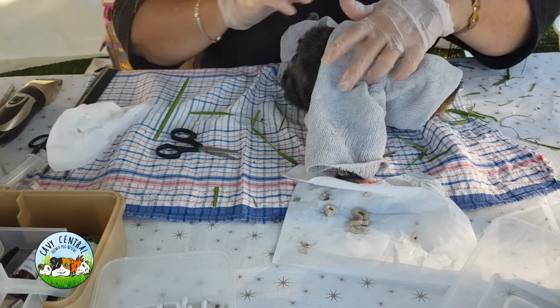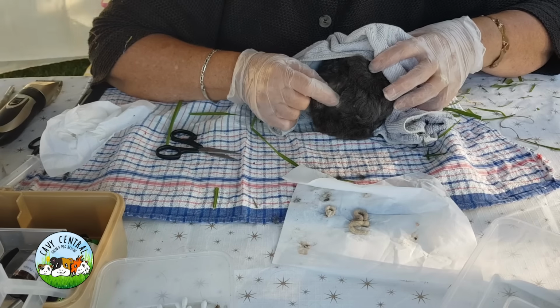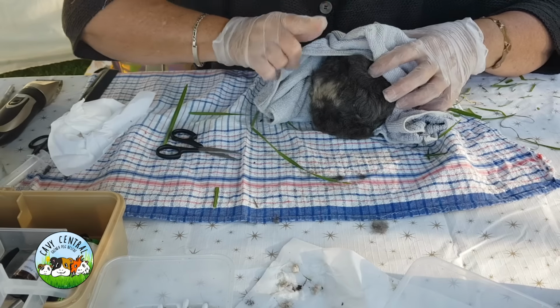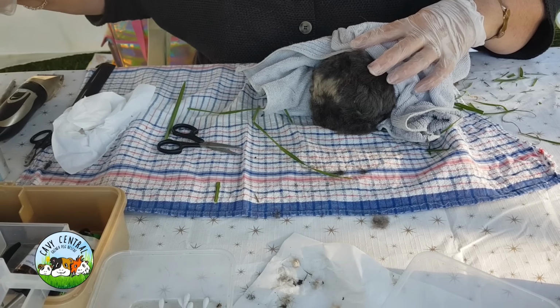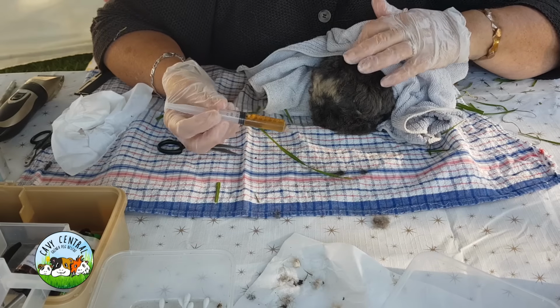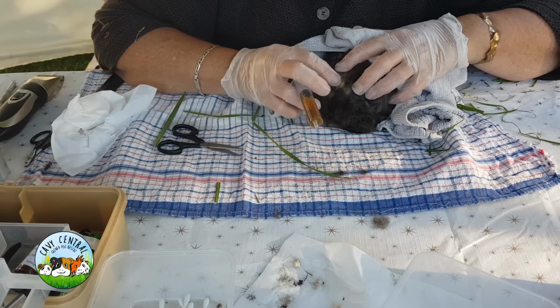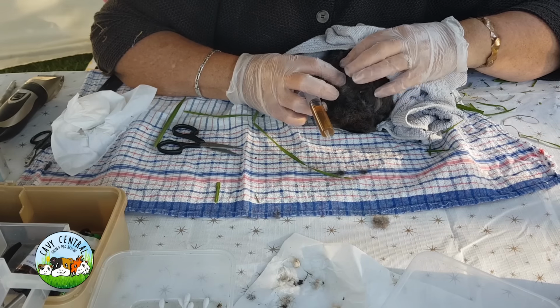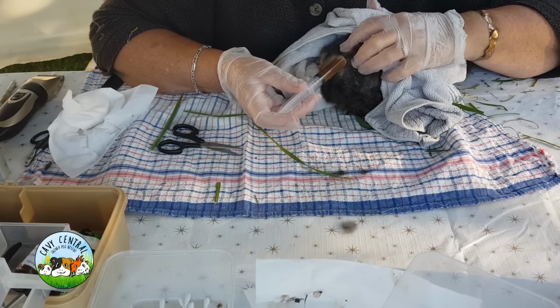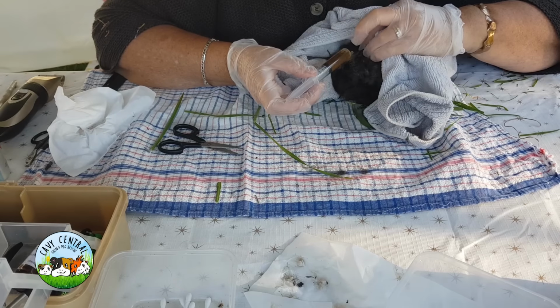And there we go. That is completely empty. Look how neat and tidy that is. Now, the contents we'll come back to after. But what we need to do now is rinse that with Debrazole. Debrazole removes necrotic tissue. Necrotic means that the tissue is basically dead or dying skin cells. And I can barely see the actual entrance point now. So what we have to do is get the Debrazole in there.